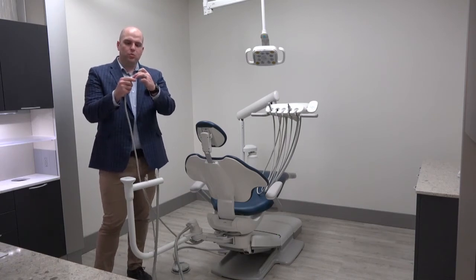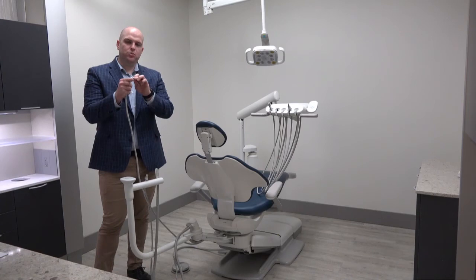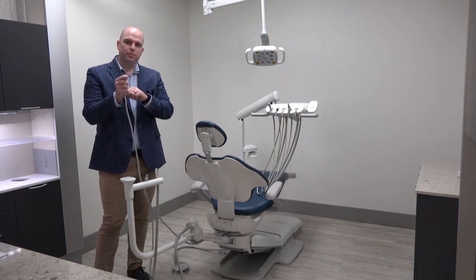Those ridges are designed to lock into three o-rings located inside of the syringe. This really helps the syringe tip lock in tightly so that it doesn't come out during an operation.